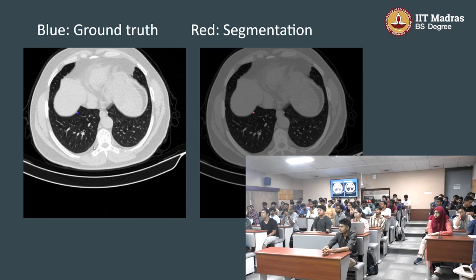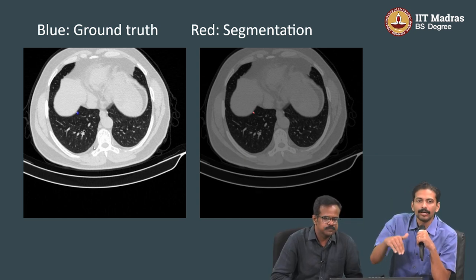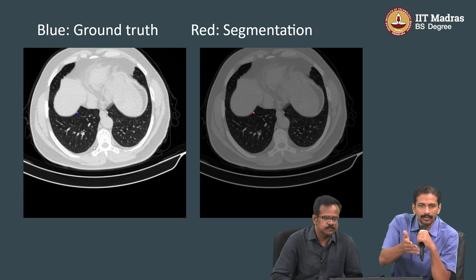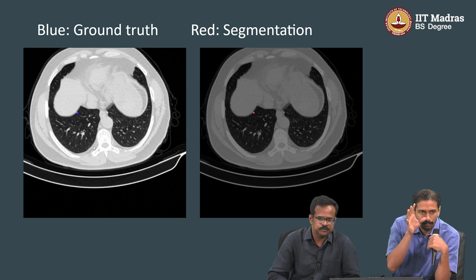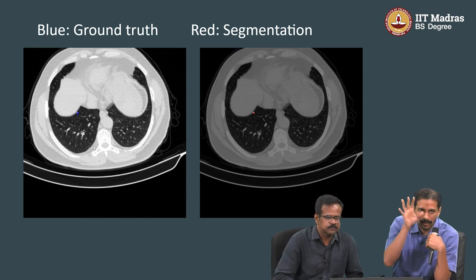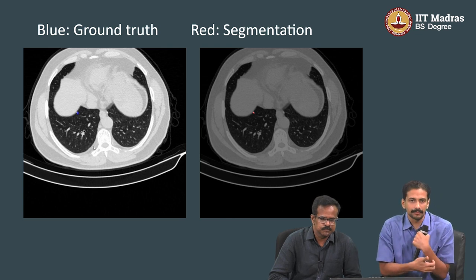DICOM. Yeah. The initial starting point is DICOM. Some software converts that into NIfTI format. There are other formats, but the starting point is going to be DICOM. The format which comes out of the machine will be DICOM. If you want to convert into anything else, it can be done.